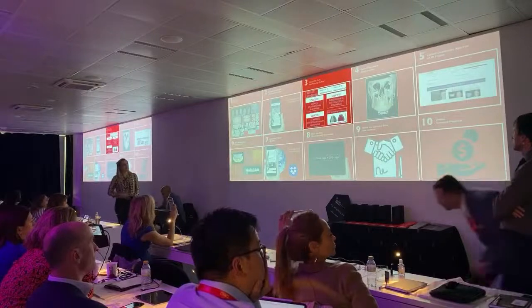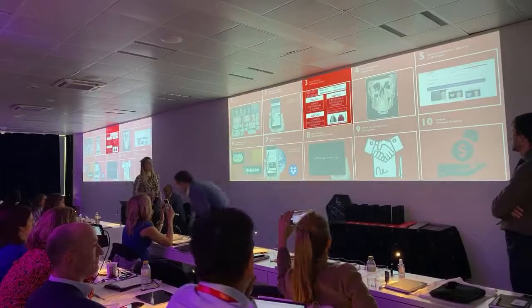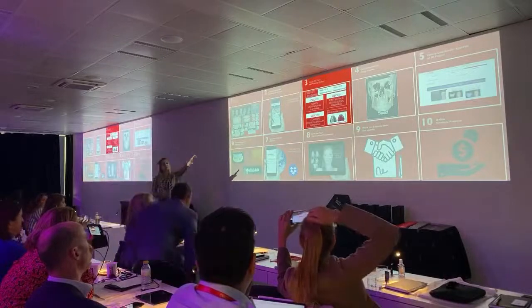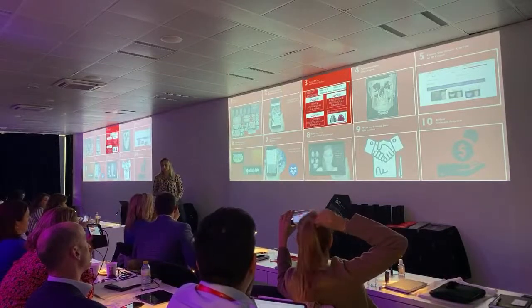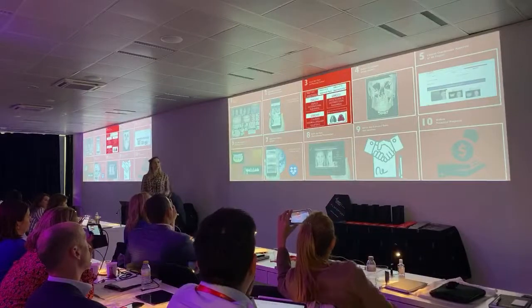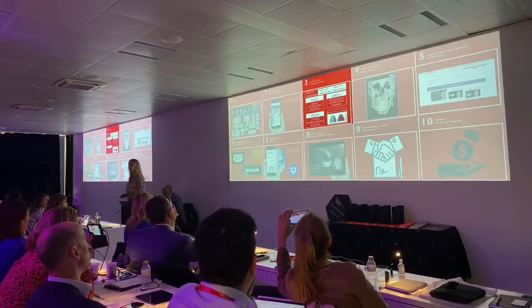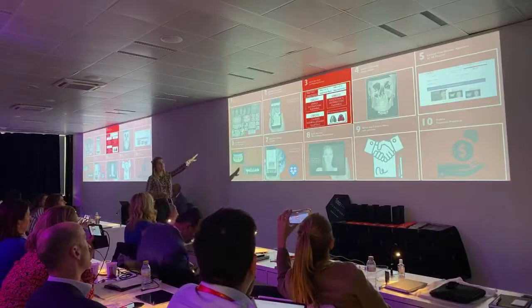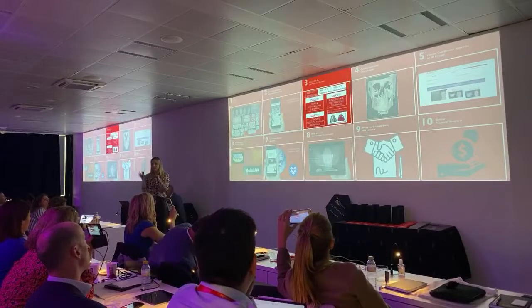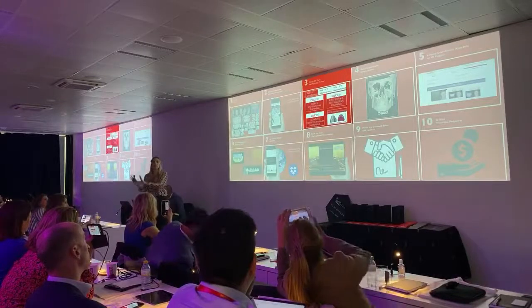And then the DSD coordinator will send the case to the planning center, and they will choose one of those 4 services, that is the planning services. In Well Clinic, I only choose DSD and Invisalign when I know it's clear that the case is only ortho and restorative.